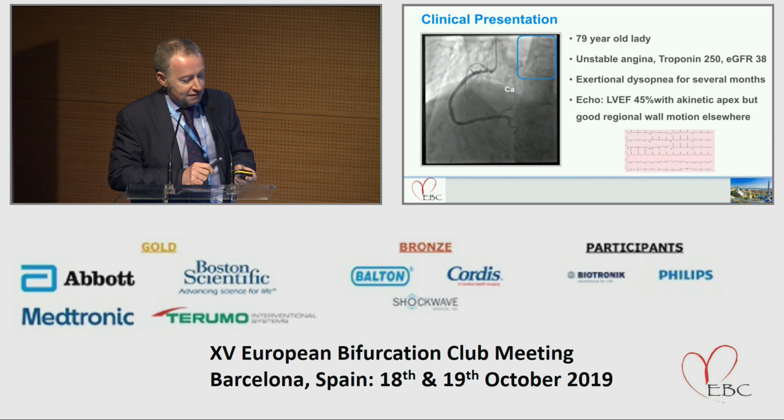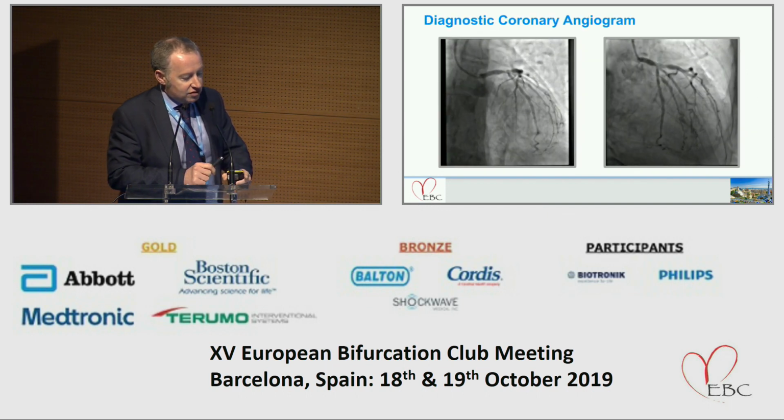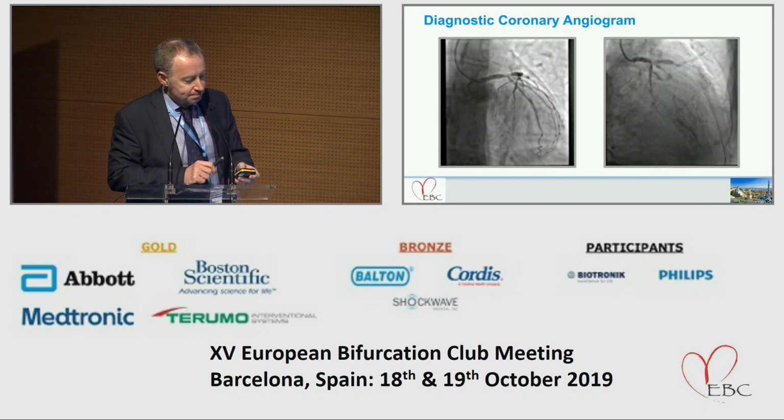That's the ECG. And you'll see with her left, well, before we did the left shots, you can see there's quite a lot of calcification just on the static angiogram for the left system. And if this one plays, here's the angiogram of the left system, as you can see. So we've got a Medina 1 classification bifurcation left main, calcification, as you can see. There's a small intermediate as well.